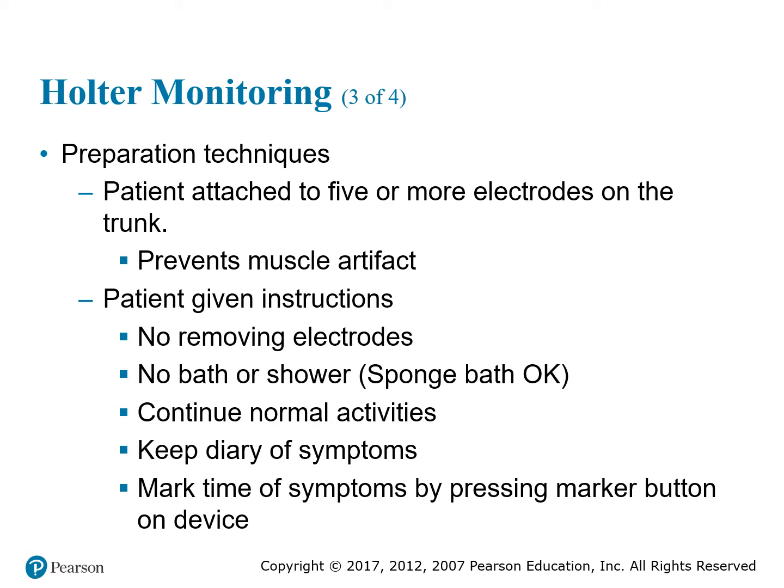All right, so we're hooking the patient up. The patient is attached to 5 or more electrodes that are put on the trunk instead of arms and legs in order to prevent muscle artifacts.